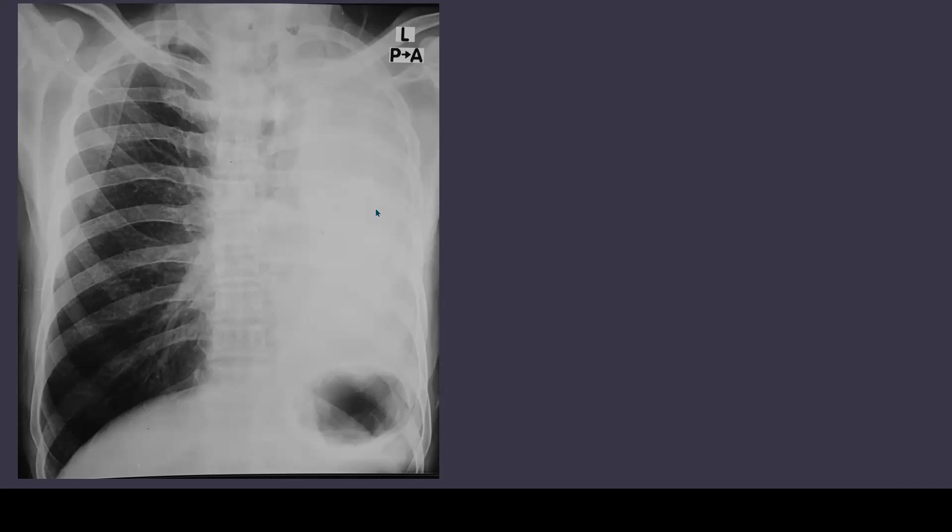If we look at the diaphragm, it is also pulled up and you can see the stomach bubble here. As you know, on the left side the diaphragm is lower compared to the right side, but this is not the case here.